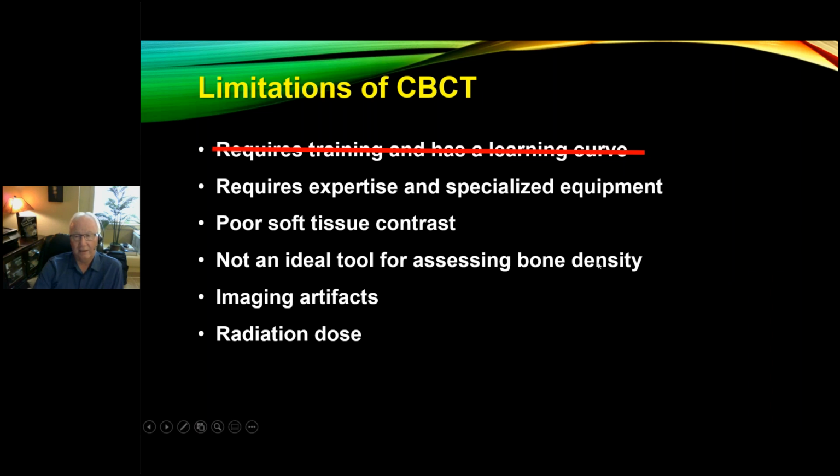They're really looking at the density, and it doesn't matter, because if you have really thick, really dense, hardly any marrow space pattern, compact bone, sometimes it's still like mush when you drill into it. You can have cancellous big spaces, looks like it shouldn't hold anything, and the implant's in there solid as a rock. So there's no correlation really between some of the tools that are out there. Use it judiciously if you have it in your software.